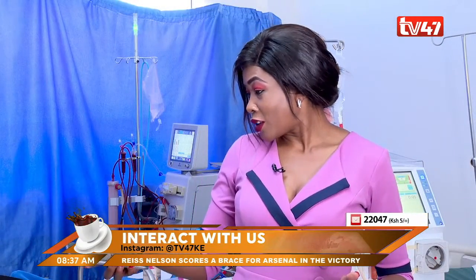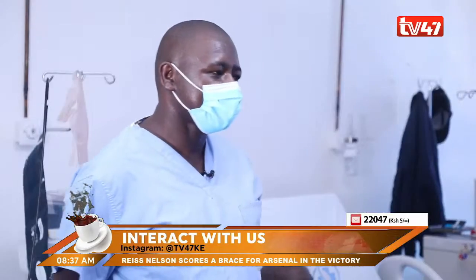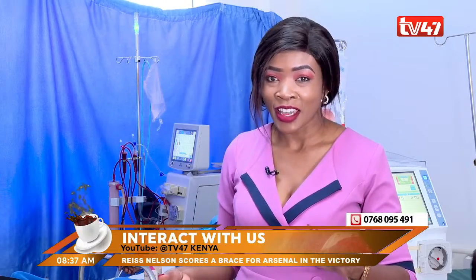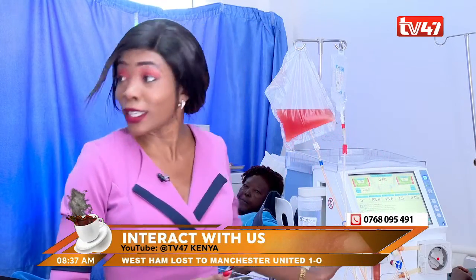Dr. Ali, I see you've put water there. So what is that water for? That is what I want to call an acid concentrator. All right, let's not rush this — I'm sure we're going to learn that. Dr. Ali tells me that we'll be using this dialysis machine. In a few, we get to learn about the basics of the dialysis procedure, just what it entails.